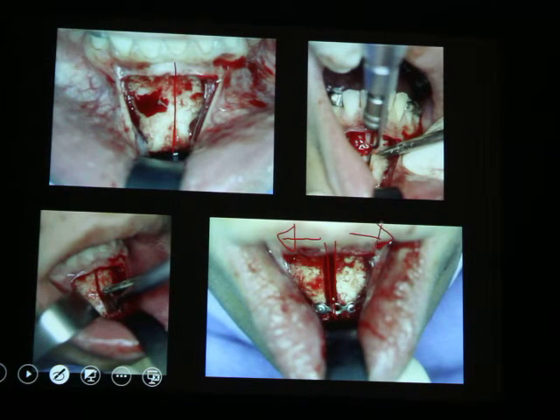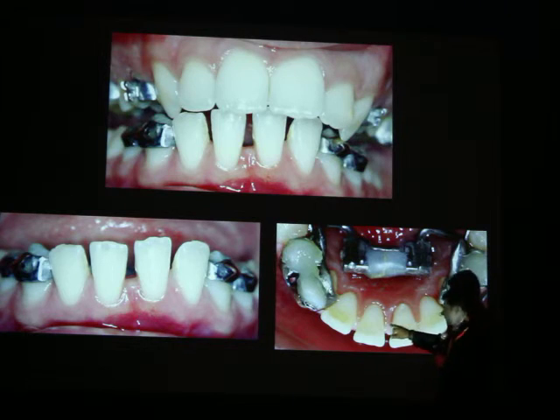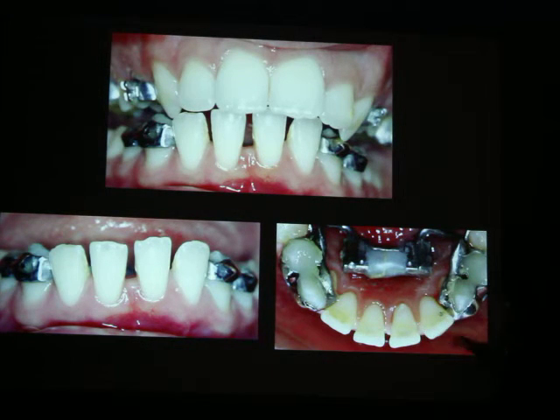We then start opening the screw, expanding the mandible. But of course, you understand that you do not get as much as you get in the upper jaw because there are no sutures here. So it's a very small gain in terms of space, in terms of millimeters. The lower jaw has no suture like the upper jaw, so the amount of expansion cannot be as large.